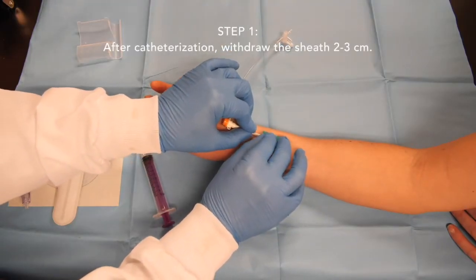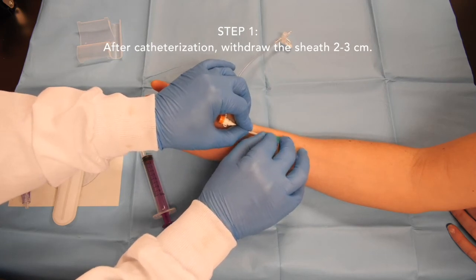After catheterization, withdraw the introducer sheath 2-3 cm.